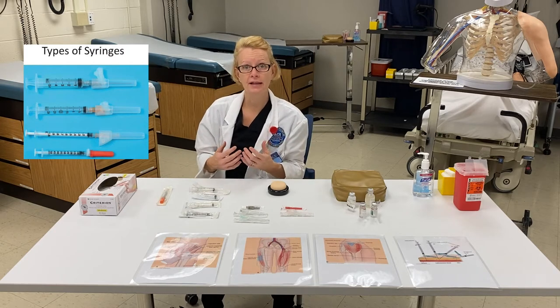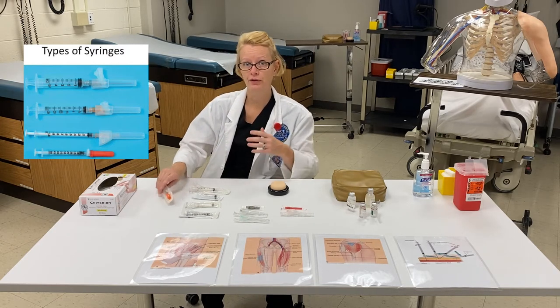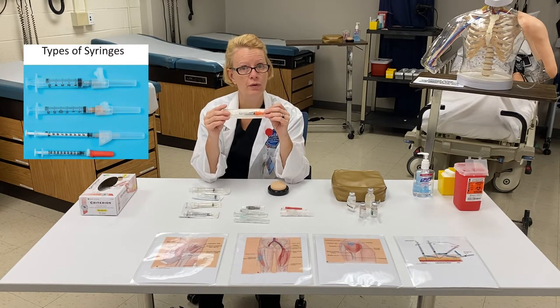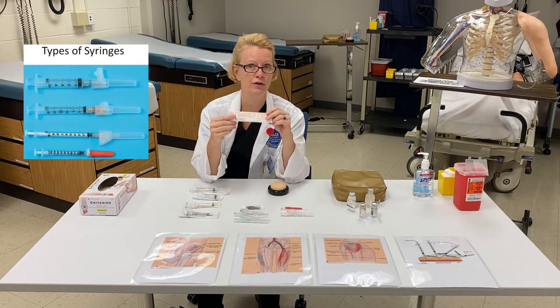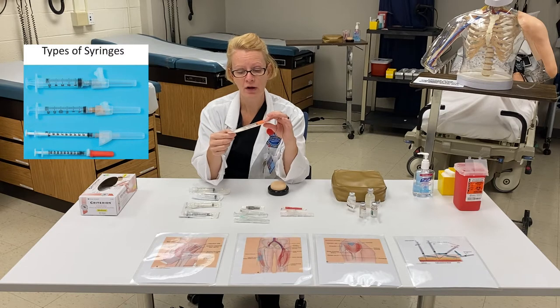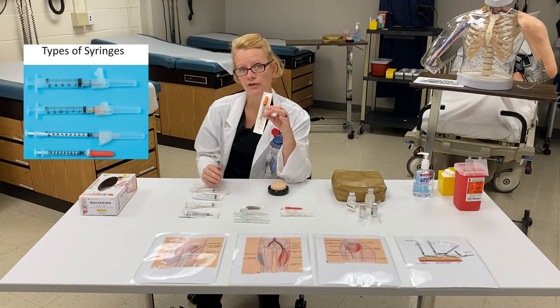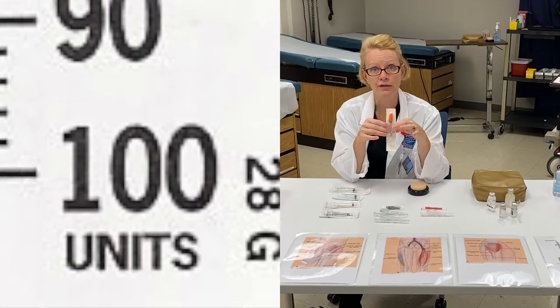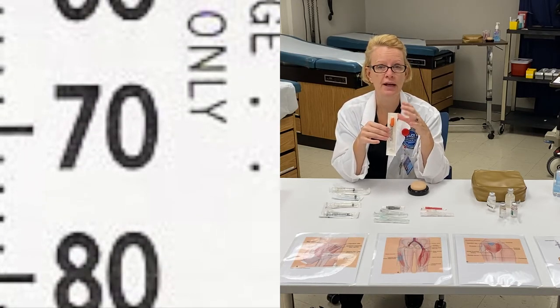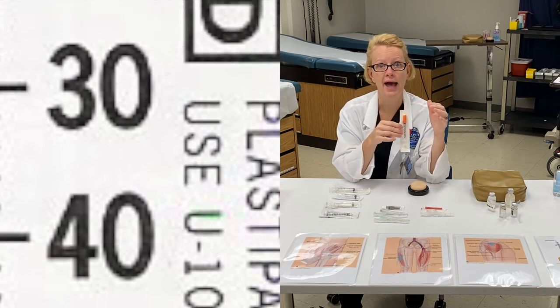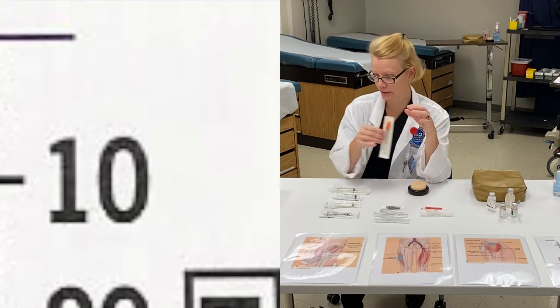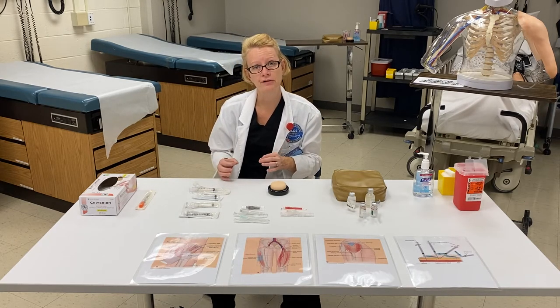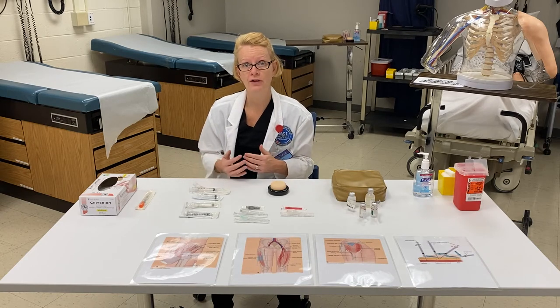However, if you are drawing up insulin, then there's no other choice for you but to use an insulin syringe. Insulin syringes tend to always be orange wherever you're working. You'll see it has an orange cap, orange writing on the packaging, and the difference between an insulin syringe and regular syringes is the unit of measurements. Instead of being measured in mls, insulin syringes are measured in units because we draw up insulin in units. I just wanted you guys to get very familiar and comfortable with the actual syringes and the different types based on the volume of medication you're drawing up.